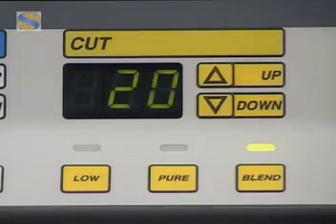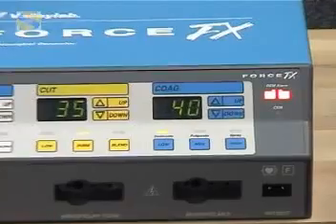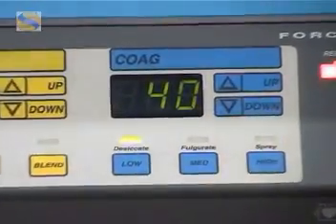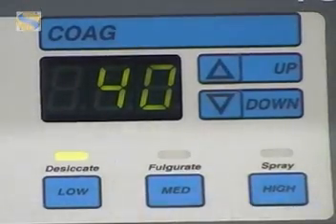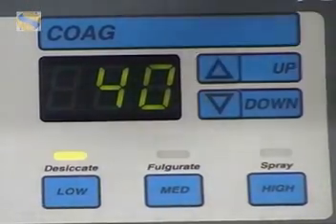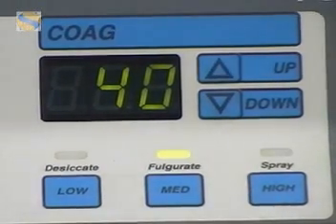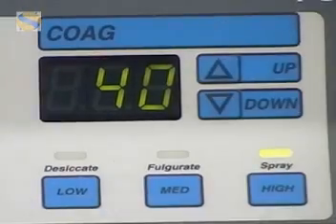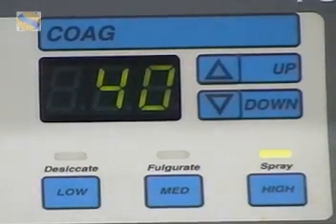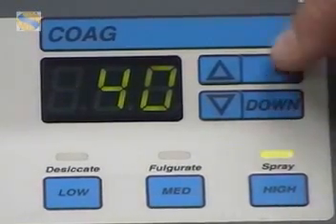To the right of the machine is the coagulation panel, which also provides 3 settings for this diathermy mode. Desiccate for contact coagulation, fulgurate, the standard setting for this mode, and spray for the superficial coagulation of larger areas of tissue. The maximum power when using coagulation is 120 watts.